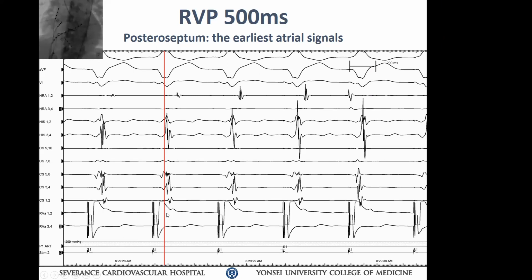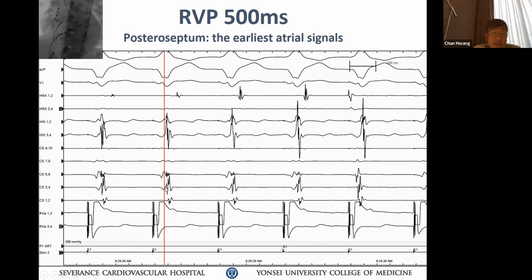Right? Yes, correct. So looking at this EGM, you got very, very nice potential in the 5, 6, and 3 and 4. What could you do better? Here. Are you happy with your EGM? What do you think? You really got a nice potential here. So you think this is what you're recording, whether it is the His? Can you point? No, not there.